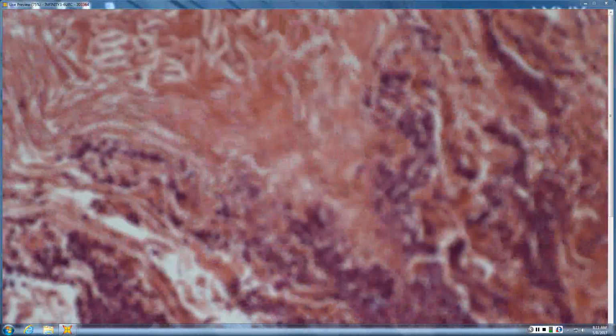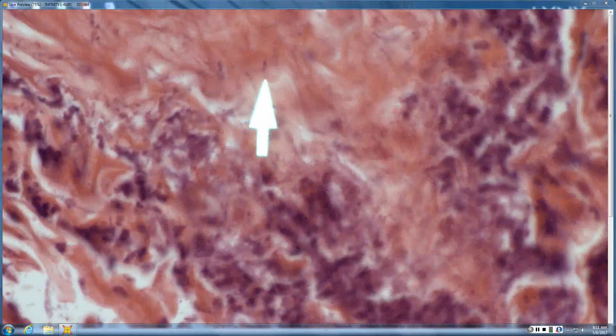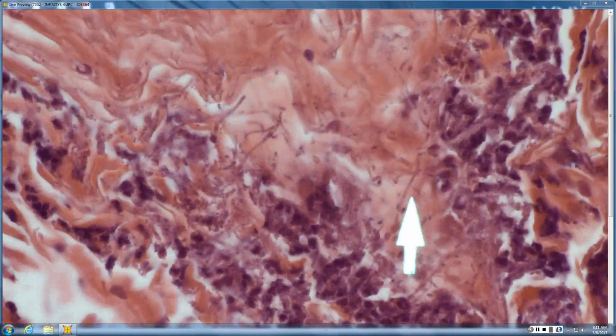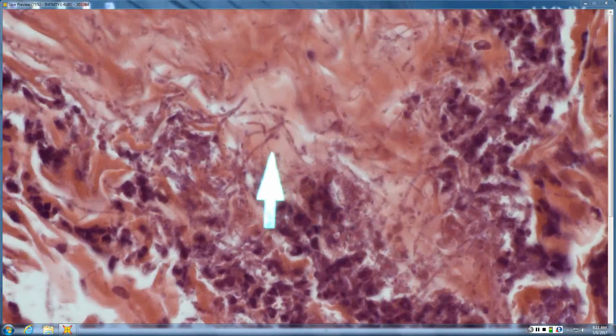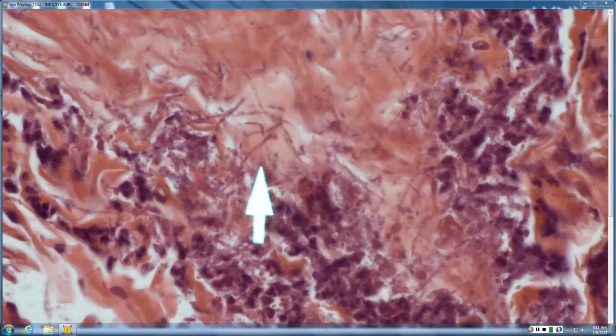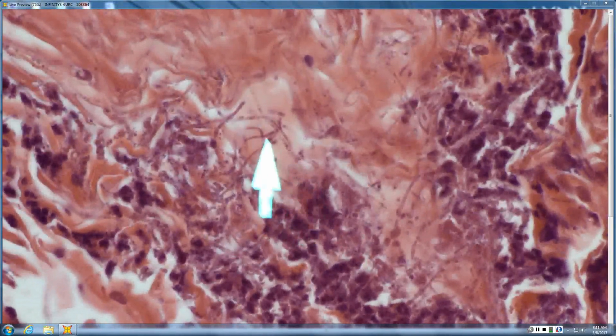Okay, so, and then we're going to look a little. That's more impetigo. Is that just bacterial colonies? Oh, wow. Whoa, look at that. Some hyphae, some more tinea. Is it either tinea or candida? Candida. And one of the hints here is you can see the swellings where they're really yeast that are germinating with germ tubes. So this was candidiasis. Just raging. That's pretty cool. But you know, you did very well with the differential.